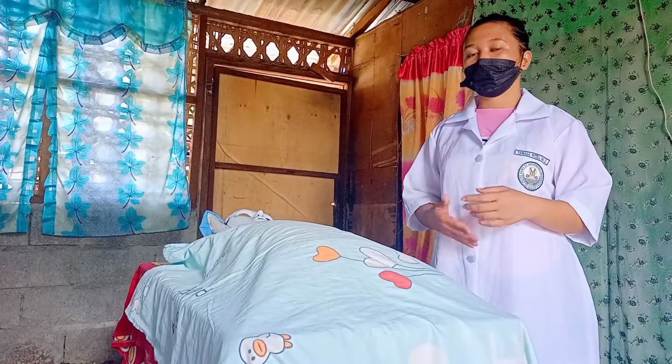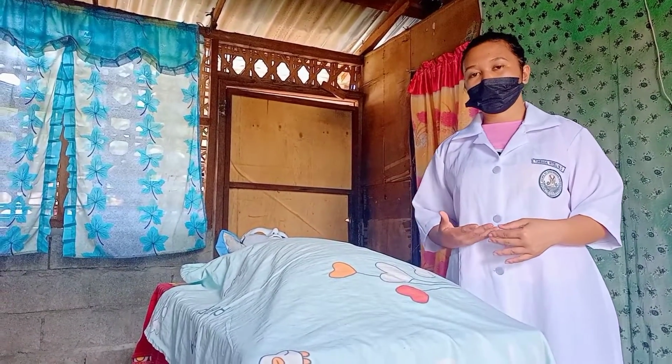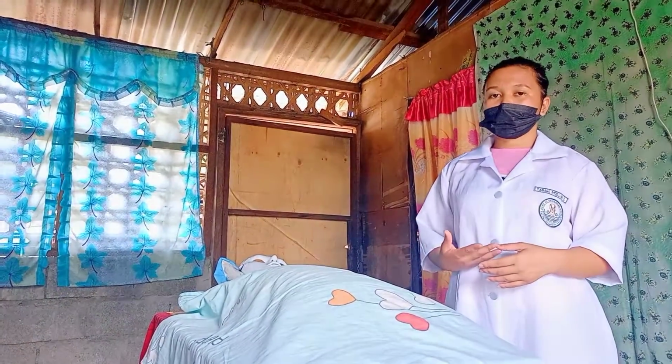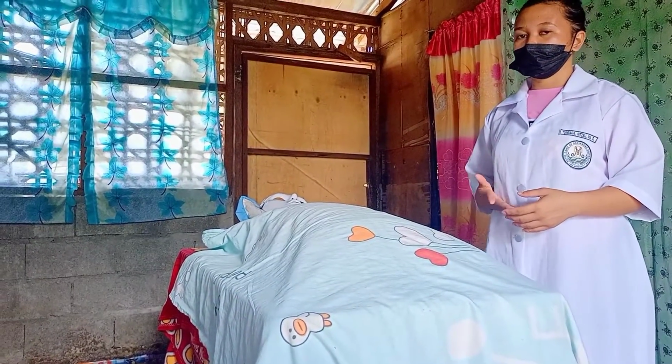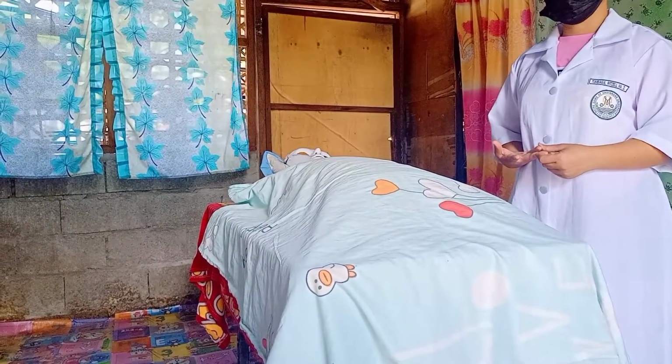For evaluation, note any difficulty with catheter insertion and also note characteristics of the urine obtained like amount, color, odor, presence of sediment or mucus. And also for documentation, document the time and date of the procedure. Document the size of the catheter used and also record the amount of distilled water used to inflate the balloon.